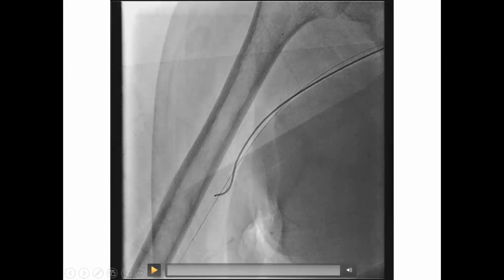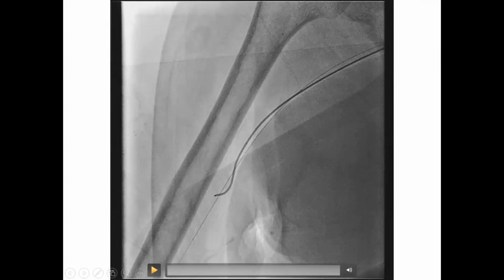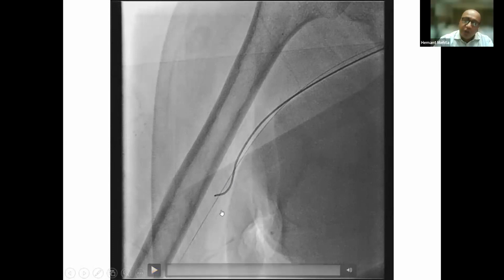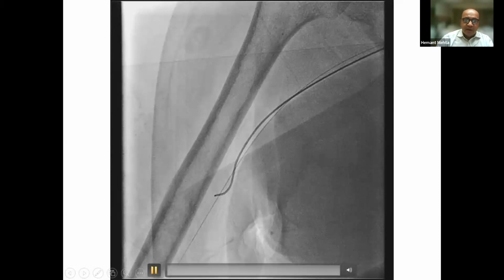This catheter is coming from where? From the artery? No, the broken piece is, we had come from the vein across the body of the fistula and parked the wire into the artery. But Hemant, where is the catheter coming from? Is it via the femoral route and through the subclavian? No, your current catheter, the H1 catheter which you put, where is it coming from? Femoral artery. That's what we're asking. Yeah, okay. This is from the femoral artery.